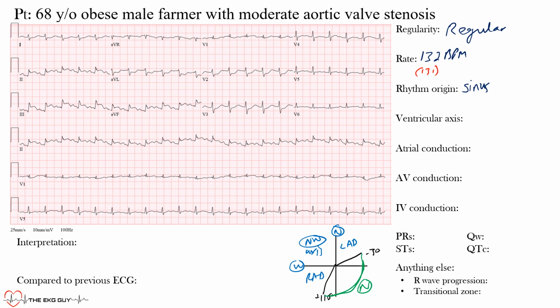And so this is in adults. Remember, in children, they have more of the right ventricles dominating, especially towards the end of gestation at around 34 to 40 weeks and up to that first week of birth. They have more of a rightward shift, the right ventricles dominating, but eventually with age, we tend to shift more leftward, okay?